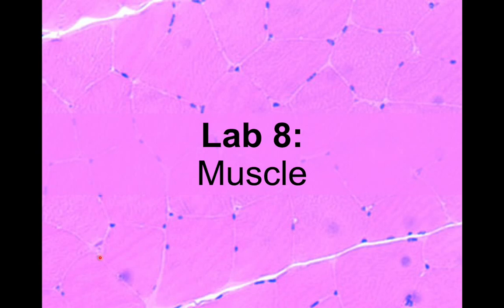Hello everyone, welcome to Lab 8. Today we're going to be discussing muscle.